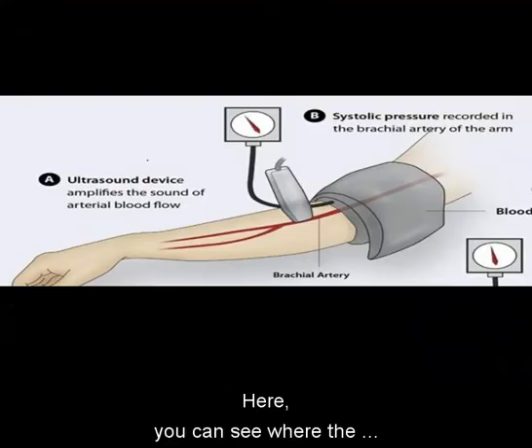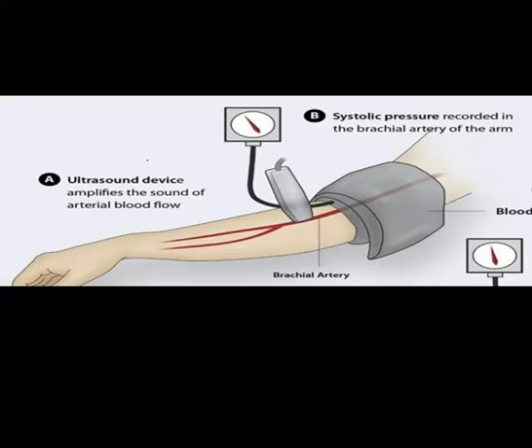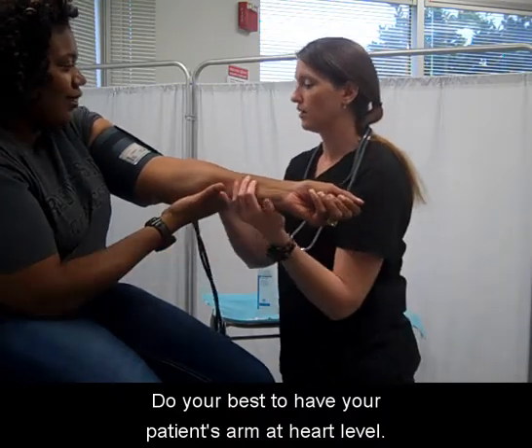Here you can see where the brachial artery is located. The cuff will go right above the antecubital space. Do your best to have your patient's arm at heart level.